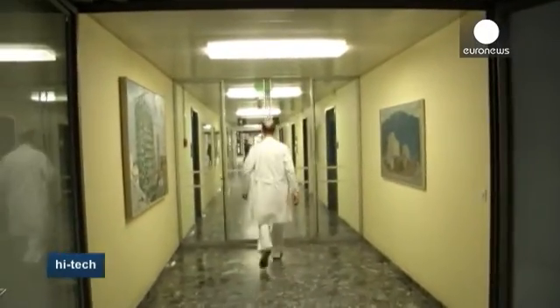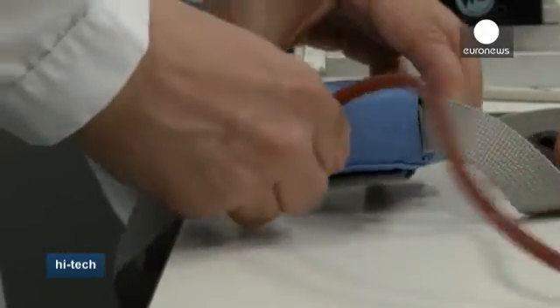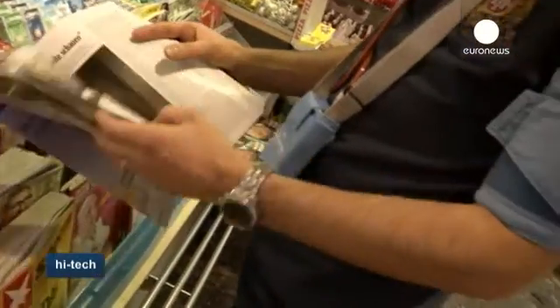The current technology used to monitor blood pressure over 24 hours demands the patient wear an armband which inflates every 20 minutes, even during the night, and is notoriously uncomfortable.